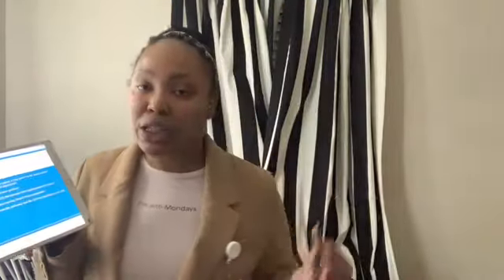Okay, so in conclusion, with the good and the bad characteristics, I do believe the wireless machine is the best option. Again, as time went on, the prices are actually good. The wireless prices are between $10,000 and $50,000, whereas the stationary products are $20,000 to $75,000. I mean, just imagine, the machines are pretty big and bulky, so it makes sense that they cost more. This is another positive to the small ultrasound machine, that it actually costs less. But in replacing a whole hospital, it would initially cost more, because you have to get rid of the old and bring in all the new.